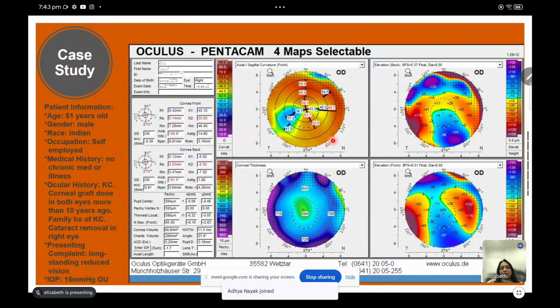So whenever I talk about my keratoconic patients or patients with irregular corneas, there's something that, as optometrists, I think it's innate in us to always want to get to 6/6 vision with all of our patients. And what we just need to bear in mind is that when we get involved with specialty lens fitting, with irregular corneas and keratoconus and grafts, we have to come to the realization that chances are we may not get to 6/6. We may not get to our gold standard vision.